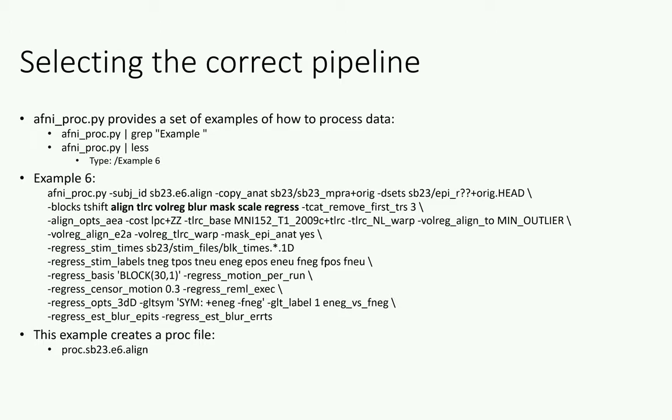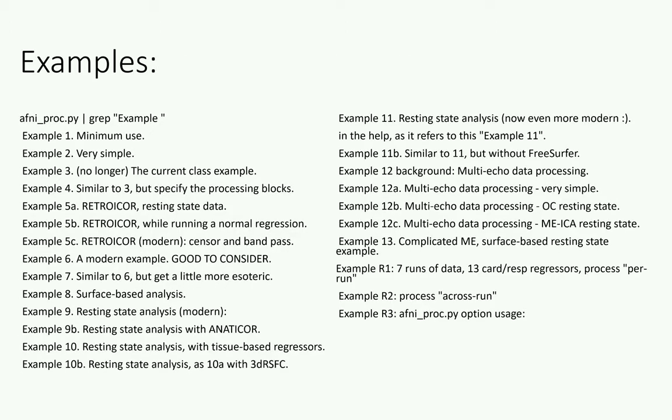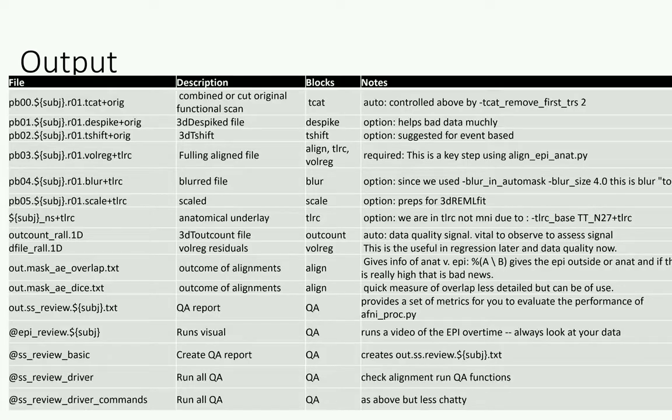And really getting into that is beyond the scope of what we're covering here today. I wanted to say that once you've got this proc file and you run this proc file, you will get some output. This is an example of getting it all through the deconvolution. Once you start doing the deconvolutions, you'll also get a stats file out. But again, we'll be handling that more specifically in following days.